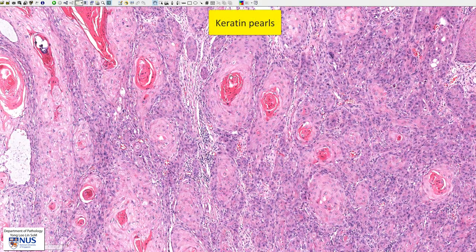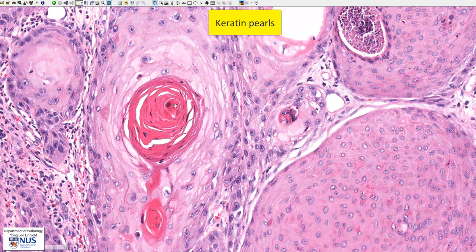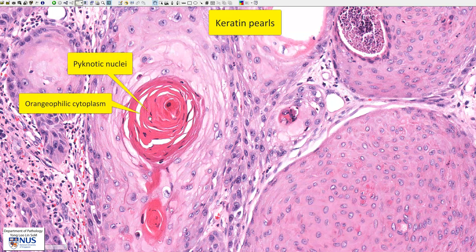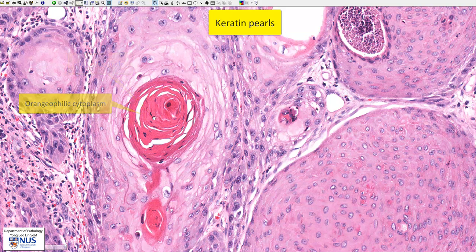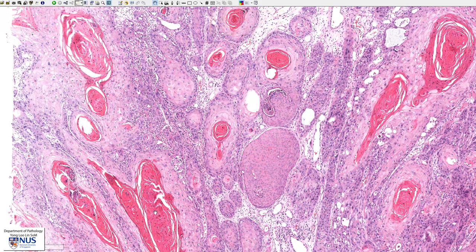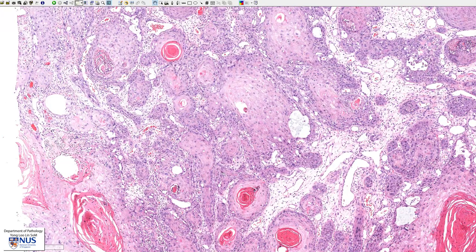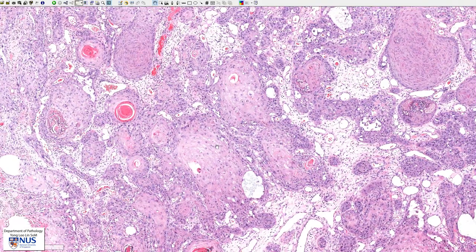Secondly, we see many keratin pearls, and these are these swirly, very orange structures. A keratin pearl appears as a concentric structure composed of compressed cells with very dark blackish pyknotic nuclei and dense orangophilic cytoplasm. When we see many keratin pearls, as we see here in this tumor, it tells us that this is a well or moderately differentiated squamous cell carcinoma. If a squamous cell carcinoma is poorly differentiated, we will hardly see any keratin pearls at all.